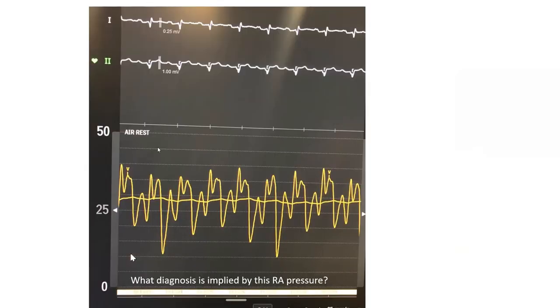This is another case — an RA pressure recording. What is the diagnosis implied by this RA pressure? This is very common and pathognomonic for one issue. This is pathognomonic for severe tricuspid regurgitation. The RA pressure is peaking in a plateaued manner in systole, looking rectangular in systole. This is what we call a ventricularized RA pressure.